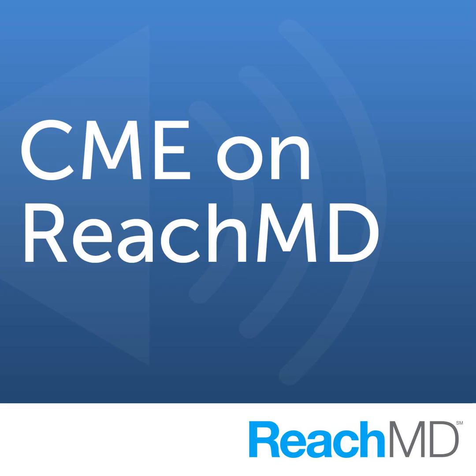Myocardial contrast echocardiography is mandatory prior to alcohol septal ablation, and echocardiography is really important in the monitoring of patients with cardiac myosin inhibitors, both during administration, dose titration, and maintenance of treatments. And with this, I would like to thank you for your attention and also draw your attention to the recently published imaging consensus paper of the EACVI for the multimodality imaging in hypertrophic cardiomyopathy, where you may find answers to many questions which were not addressed in my talk.